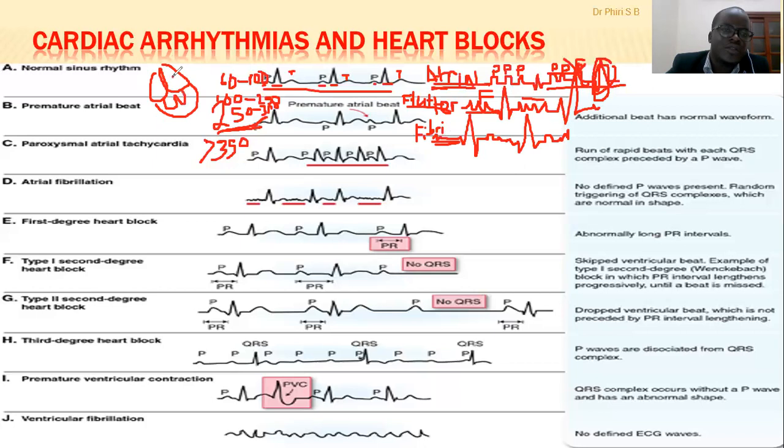If you have foci of cells producing action potentials, you have a lot of waves that bring about these flutter waves. So they can't be positive or negative. It produces more of a zigzag line, then a QRS complex, then a zigzag line, then a QRS complex. So you still have contraction of the ventricles. You don't worry much because it's just the atria.